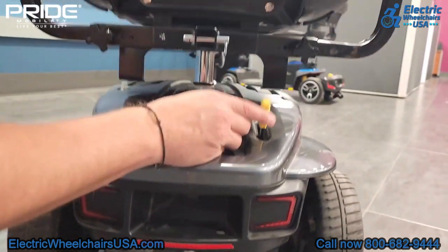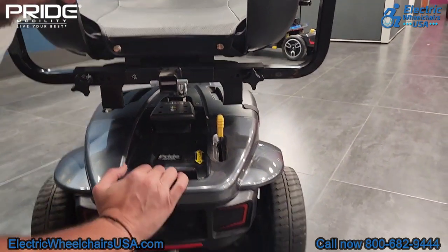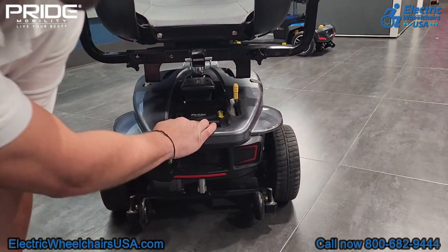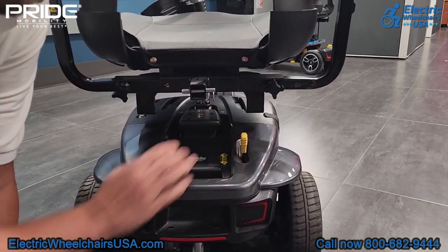This yellow lever is your freewheel lever, so if you were to run out of battery life, you just press the lever forward and that puts the scooter in neutral, so you can easily push it back to your destination. Just keep in mind that you can't operate it when it's in the freewheel mode. You have to put the lever back down into the drive position, and that's when you can actually operate the scooter.